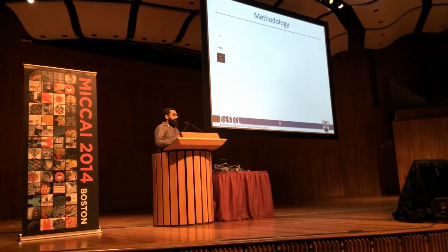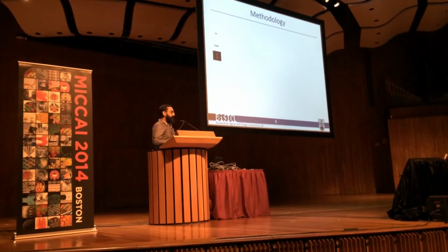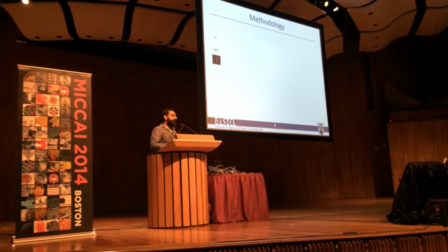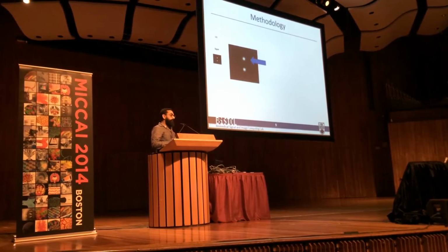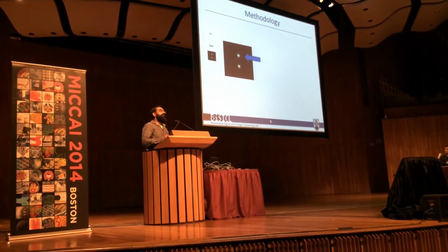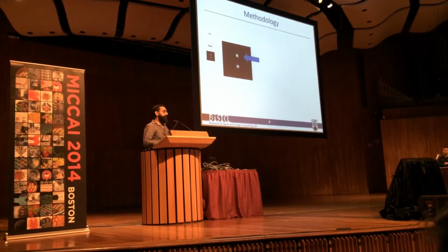So, to expose the method in a very intuitive way, I will use this framework. Take, for example, an input video with localized motion. If we zoom into this video, the subtle motion is visible on the top circle. We know from wavelet theory that local motion is related to the change in local phase.